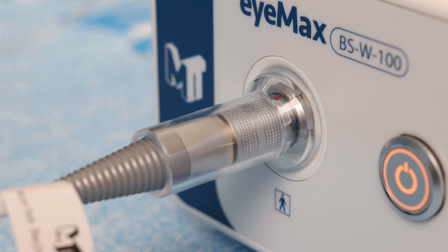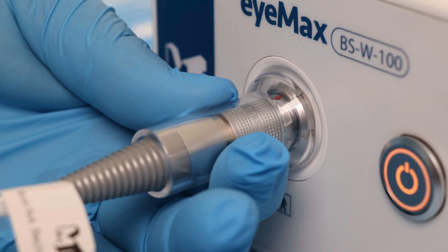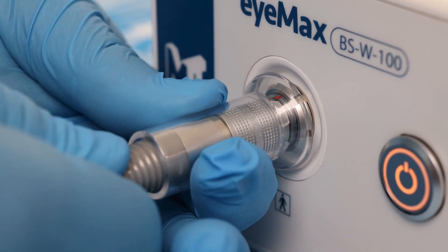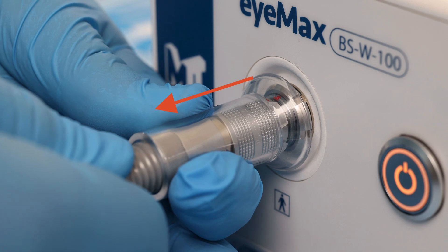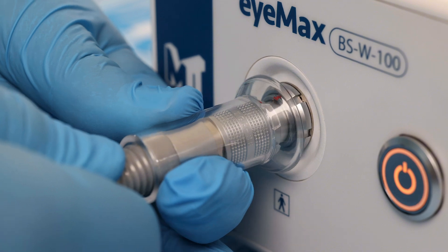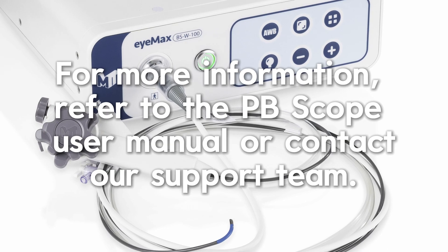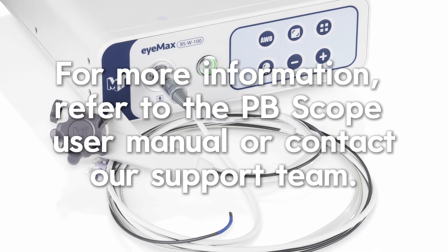When removing the IMAX scope from the controller, with two hands, place one on the data cable connector of the scope and the other on the boot of the data cable just before the connector. Pull back on the data cable connector while leaving the other hand holding the boot of the data cable stationary. Withdraw both hands simultaneously to disconnect the scope from the controller. By following these steps, you ensure the IMAX scope is ready for use.